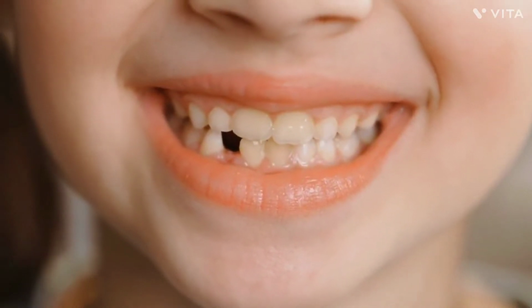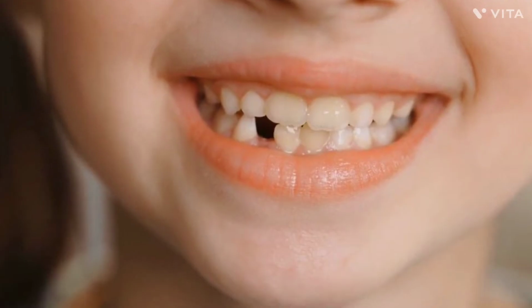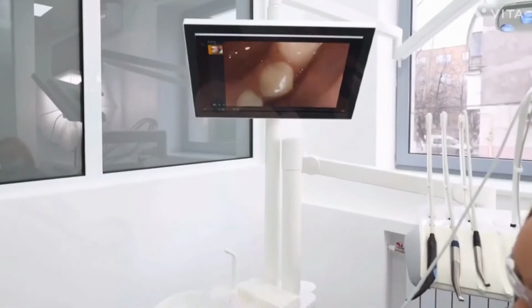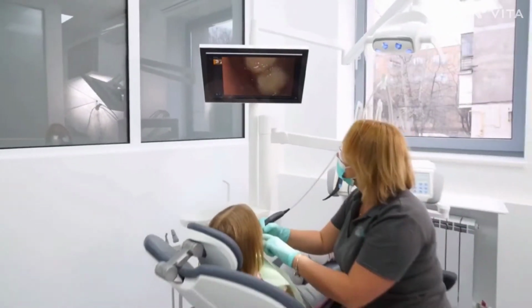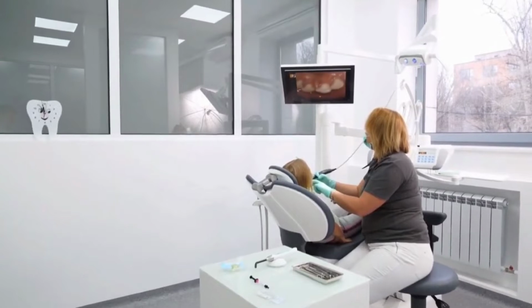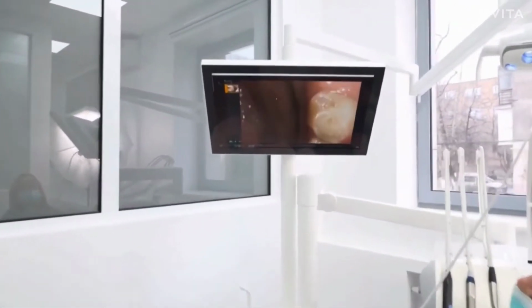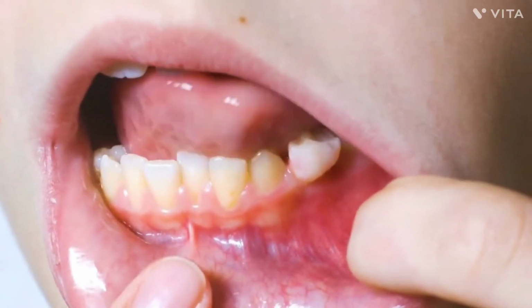Because you see, primary teeth are smaller as compared to the permanent teeth. Crowns of primary teeth are more bulbous than that of the permanent teeth. And this is the reason the beaks and handles of a primary extraction forceps are smaller. This is to accommodate the more bulbous crown, and also the beaks are more curved.